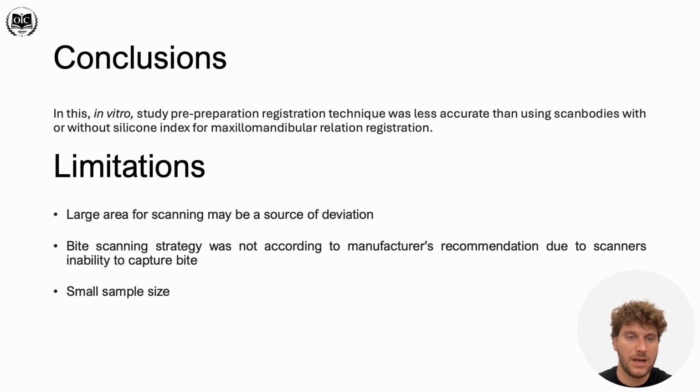And we concluded that this technique is less accurate than other used techniques, but we need to have in mind that the cutout hole in the palatal area was relatively small, and with a bigger visible palatal area for the scanner, the results should improve.